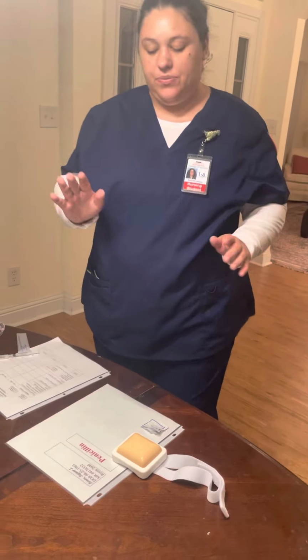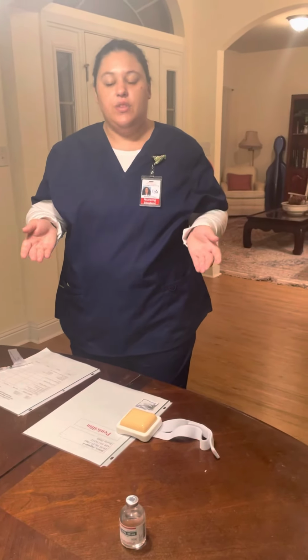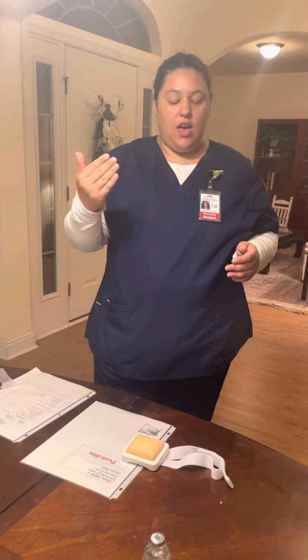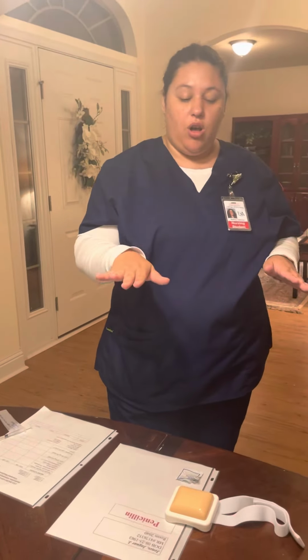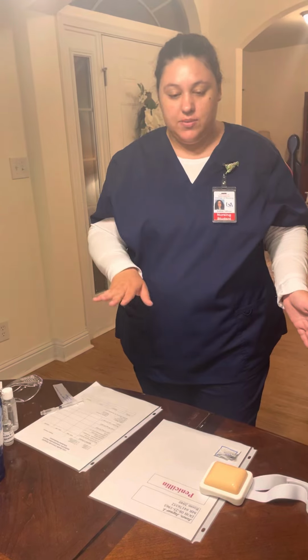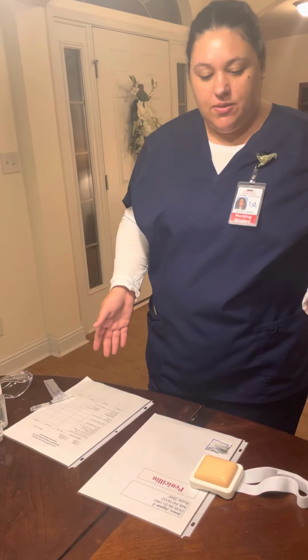You're not too low. Okay, so I'm gonna let you know what I'm gonna do. I'm gonna raise you up to a comfortable height. I'm gonna put down the rail. I'm gonna expose your abdomen. And I am going to administer the needle 2 inches away from the umbilicus, not above the intercostal space and not below the pubis space. And I'm gonna make sure that there's no bruises or anything. So I'm gonna raise you up. Are you cool with that? Do you have any questions about your medicine or anything before I start? Okay, so I'm gonna raise you up.